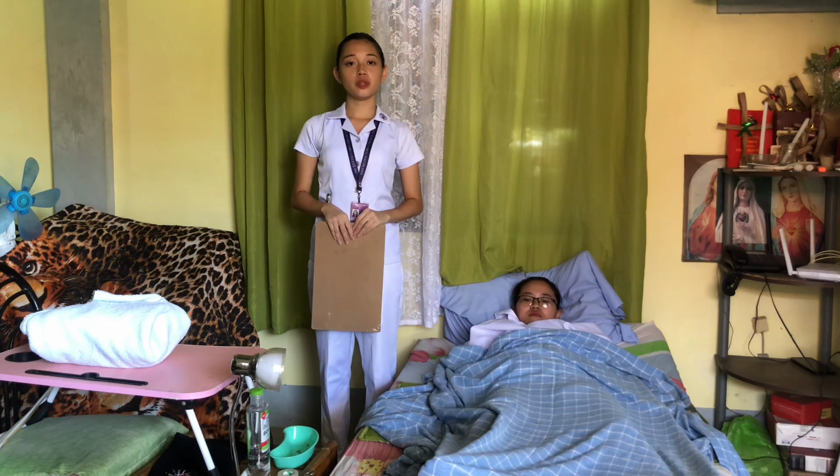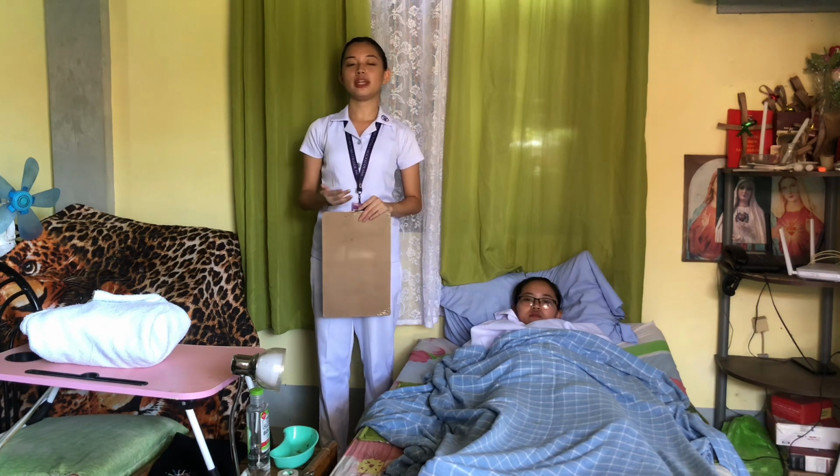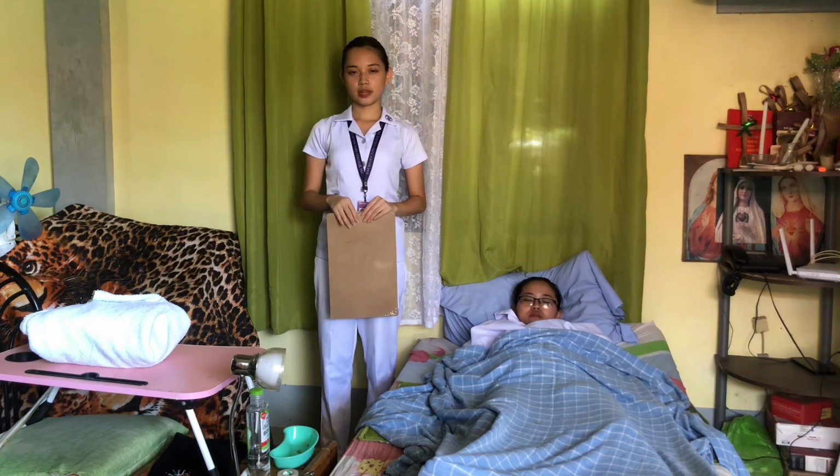Debs Clavicillas from BSN 212A Group 2, and today I will perform the female urinary catheterization return demonstration. So urinary catheterization is the insertion of a catheter into a patient's bladder. The catheter is used as a conduit to drain urine from the bladder into an attached bag or container.